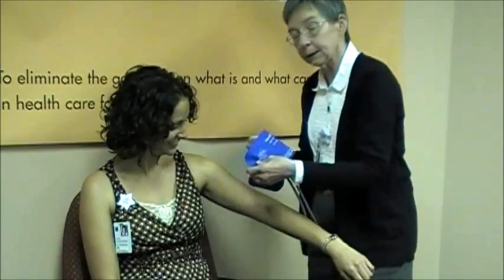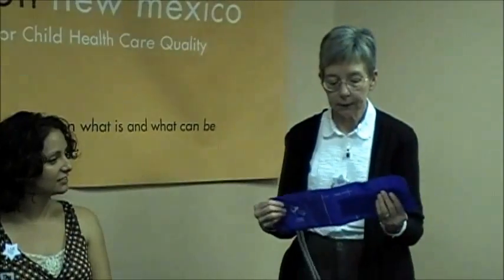But for many of your kids, it may fit. We actually had a kid this week who was a little over two, and this was the cuff that fit. So it might work for children.